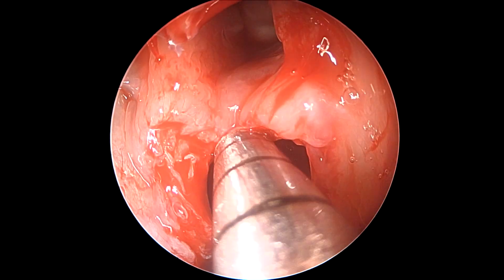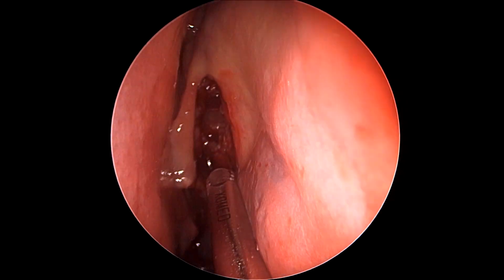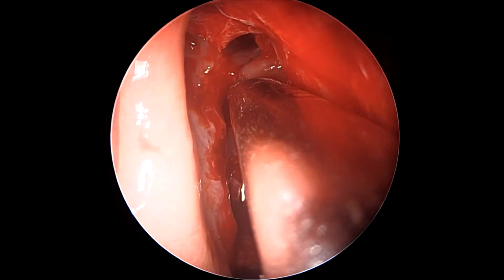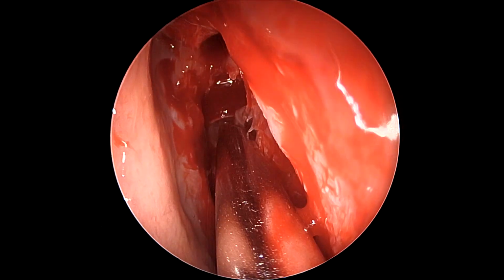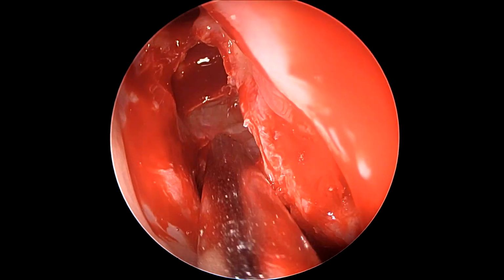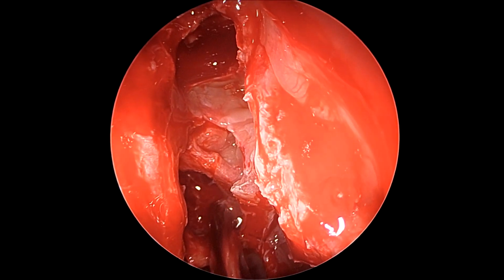As you see here, some minor septations are there, but the ethmoidal dissection appears to me quite okay. We will still examine if there are some recesses left that need to be opened even more. So let me use a microdebrider to just briefly and minutely trim the excess redundant mucosa, while at the same time ensuring that we do not cause any circumferential scarring inside the frontal recess, because that is sure to cause stenosis in the frontal recess, which is already quite narrow.